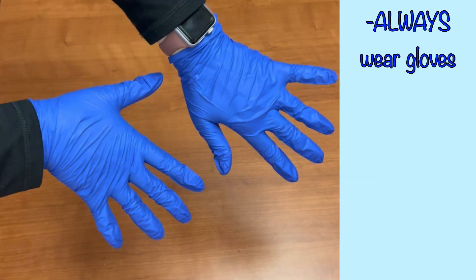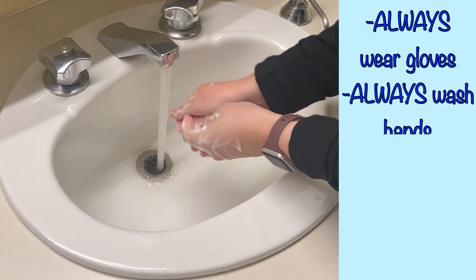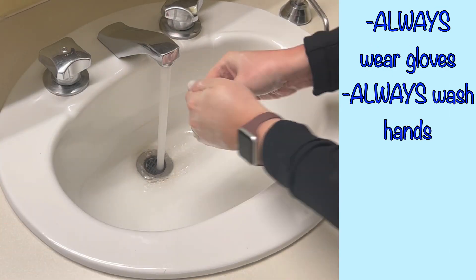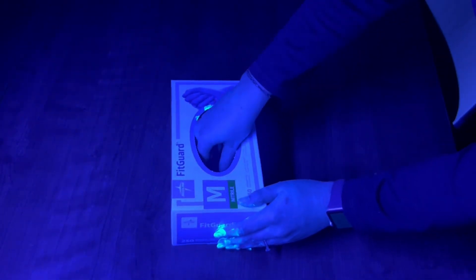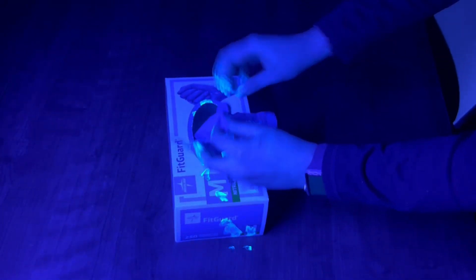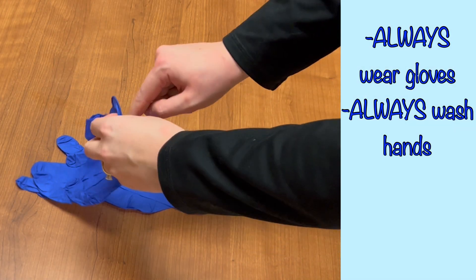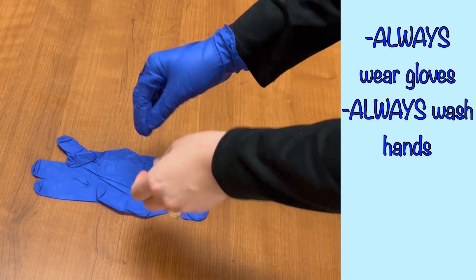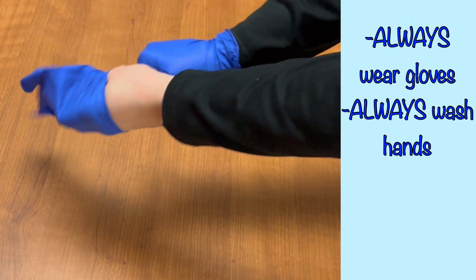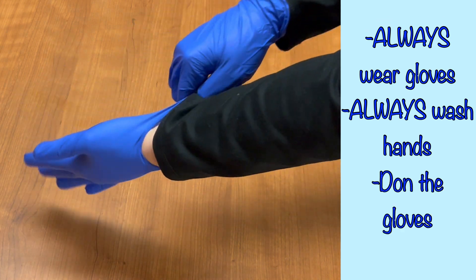Gloves should always be worn when in contact with a patient. Before donning gloves, always wash or disinfect your hands, which you should be doing any time you walk into a room. You don't want to risk contaminating the box or other gloves if your hands are already carrying contaminants. When donning clean gloves, there isn't much to the technique. Clean gloves are not meant to be sterile — they protect the wearer from contaminating their hands. When the hands are clean and the gloves are clean, simply put on the gloves.